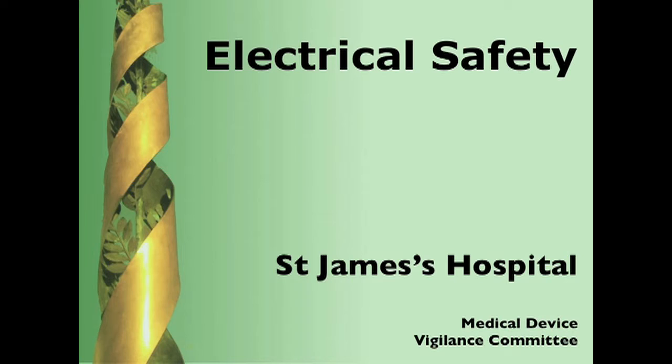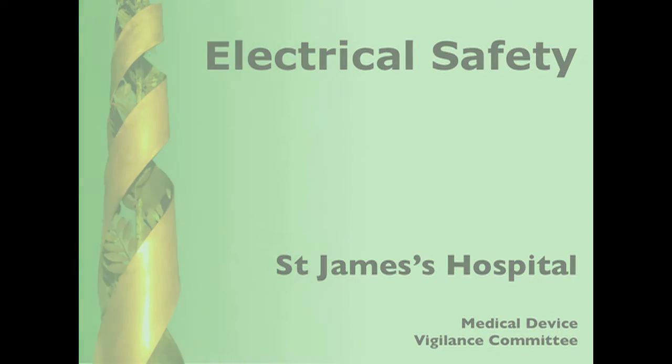The electrical supply system and the devices we connect to it are carefully designed with safety in mind. When used appropriately, these devices are safe. Nevertheless, there is a need for all members of staff to take care when using electrical devices and to report faults when they see them.